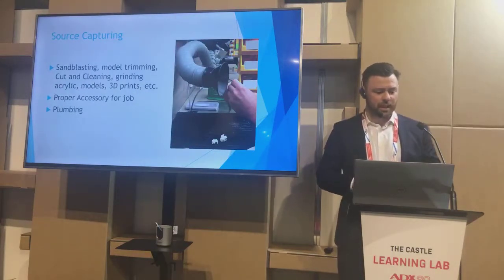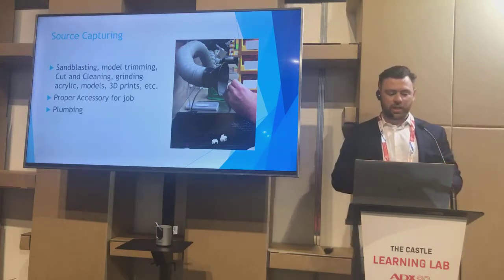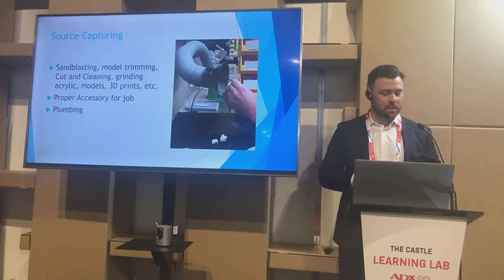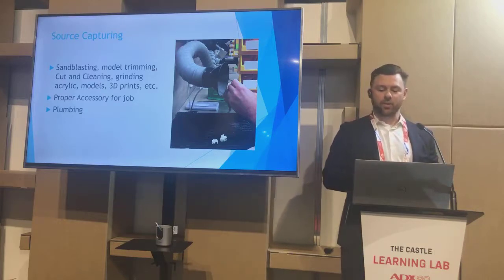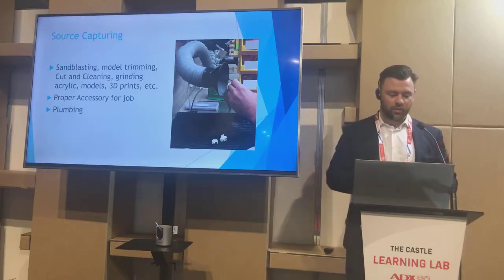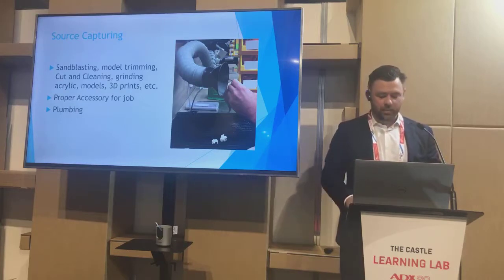Source capturing is basically sandblasting, model trimming, cutting and cleaning, that's cutting the restorations out of the zirconia pucks. Grinding, acrylic, models, 3D printing, all of those things require a different type of source capturing. I'll get into more detail in a little bit. The proper accessory is tied to each one of those types of dust creation devices. And then the plumbing.